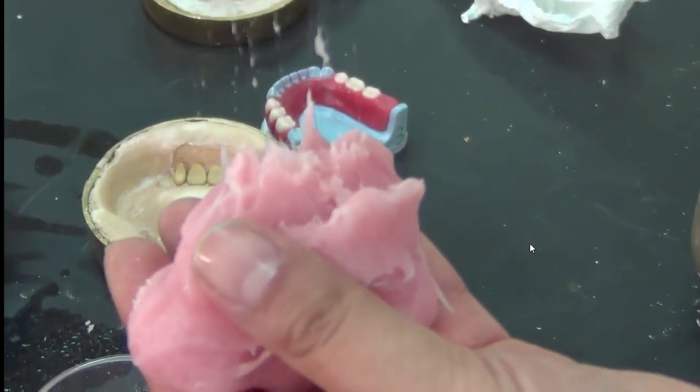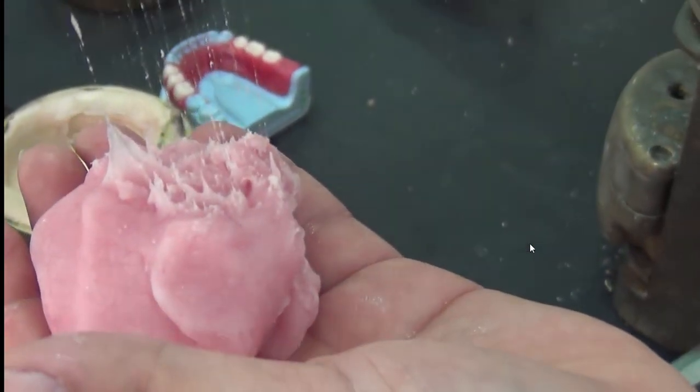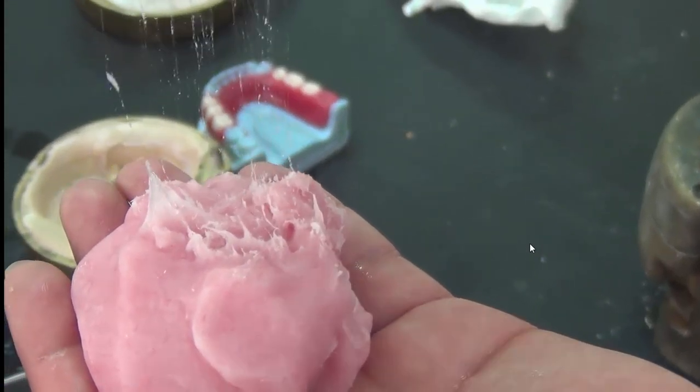So we took it out to show you the strings even better. These strings occur when the powder is partially dissolved and not yet totally soaked with the monomer. The monomer is still on the surface.